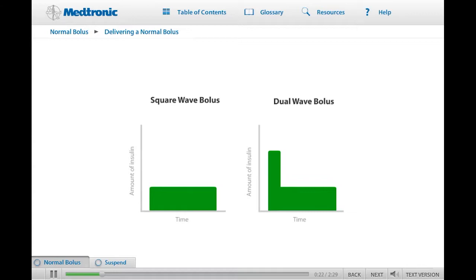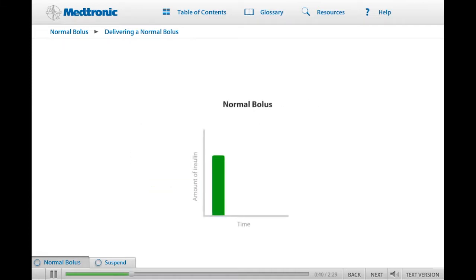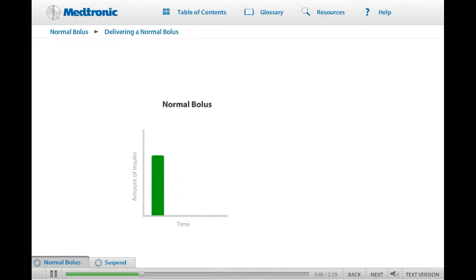Square and dual wave boluses are designed to deliver insulin over an extended period of time. These boluses can be customized to meet your needs and to match different types of food. You will learn how to program square and dual wave boluses later in your training. In this lesson, we will demonstrate how to give a normal bolus, which is the type of bolus most frequently used when first starting on a pump.